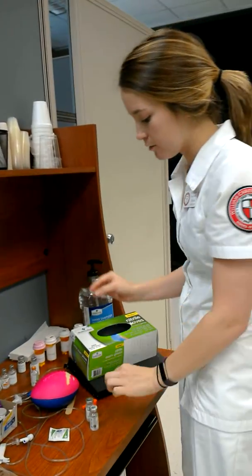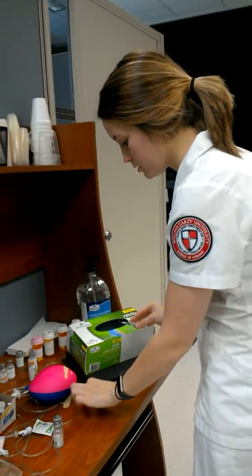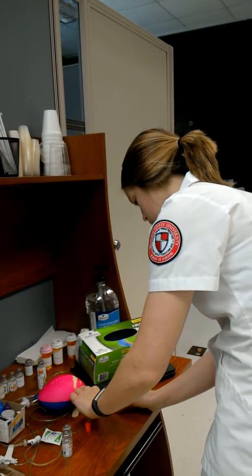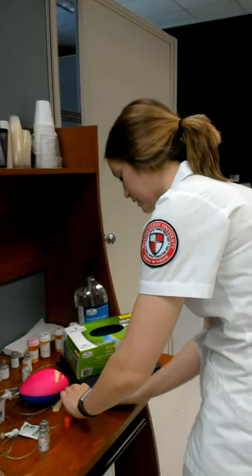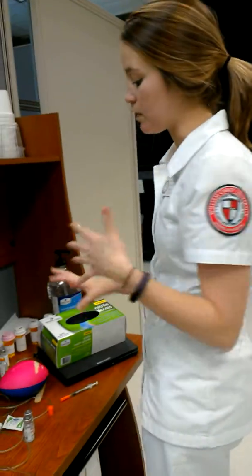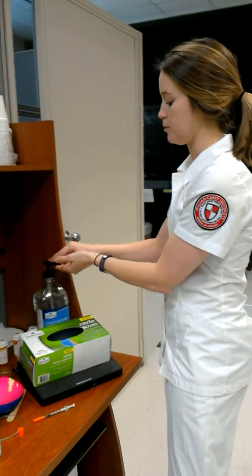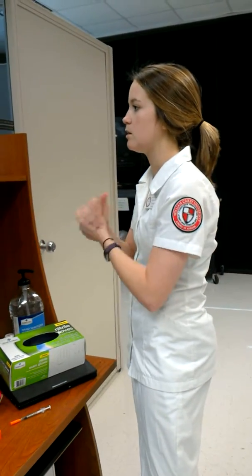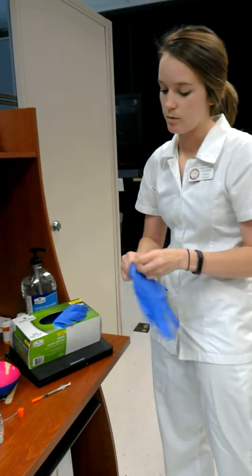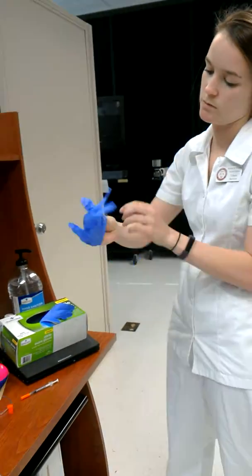So I have my insulin. I'm going to go ahead and carefully just recap it and label it for my patient and all of that. So then I'm going to go to my patient's room. I'm going to perform some hand hygiene. I'm going to put on some gloves before I administer.